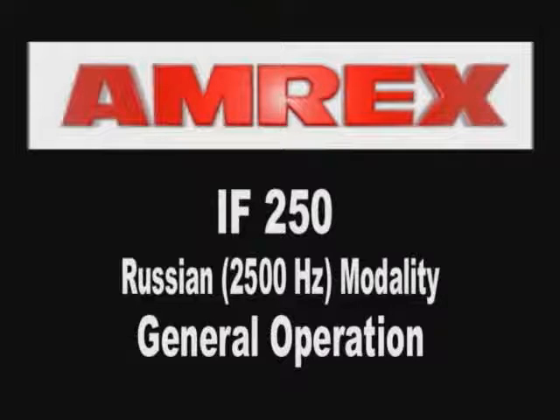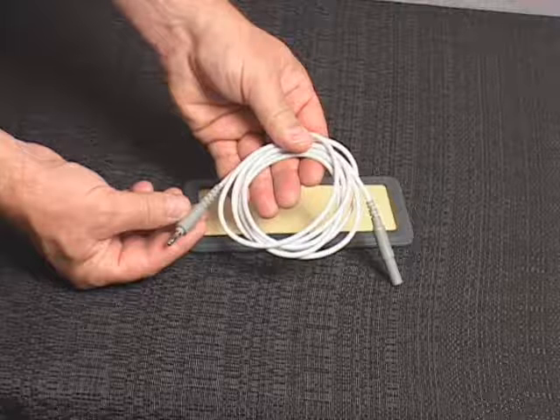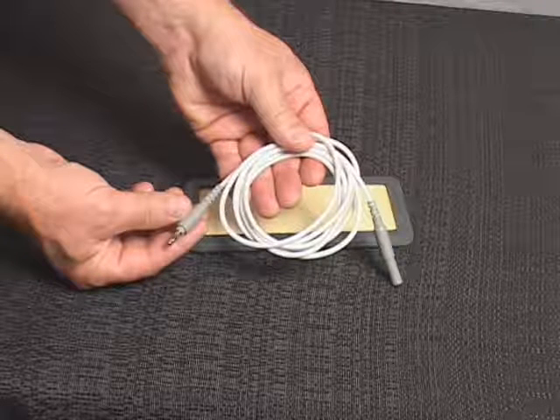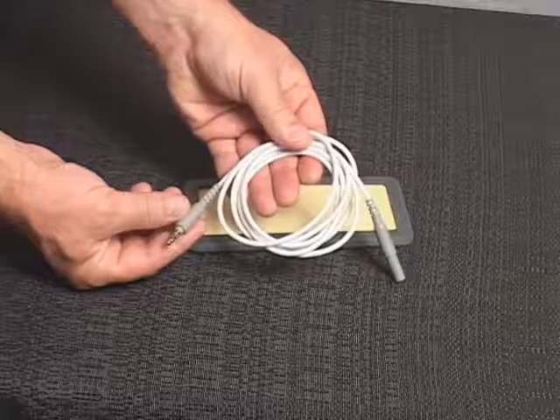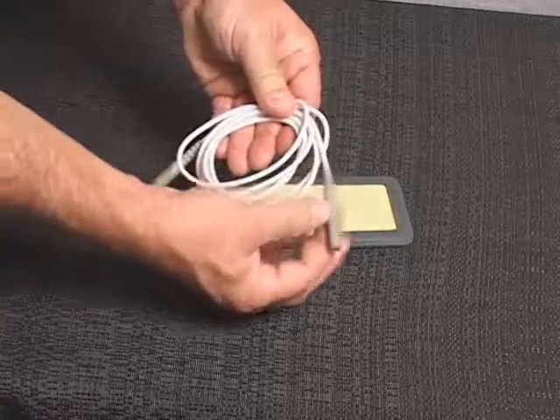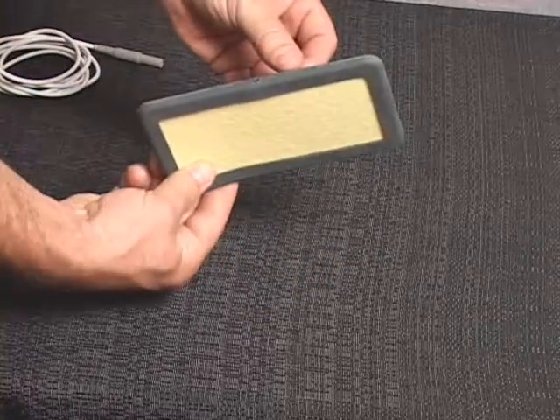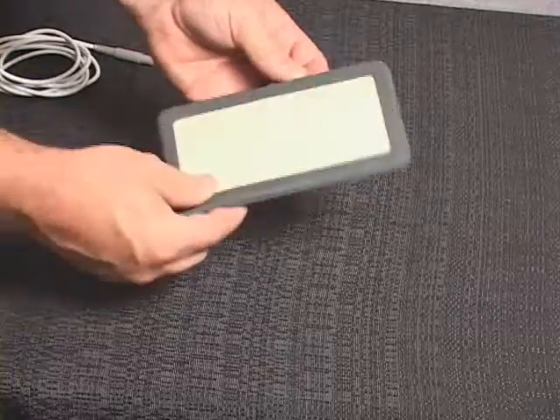General operation of Russian 2500 Hz modality IF-250. The patient leads should always be checked for proper connection and damage or deterioration prior to treatment. Loose connections or damaged cables can cause low stimulation output, no stimulation output, or sudden irregular increases in output, resulting in possible discomfort to the patient.